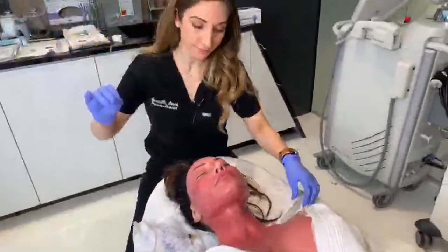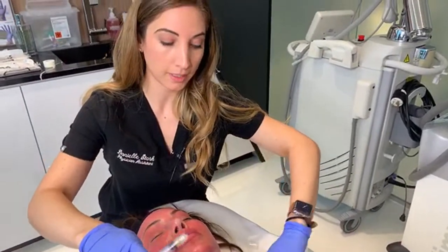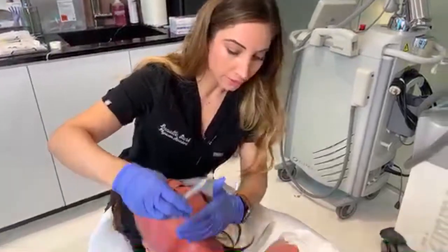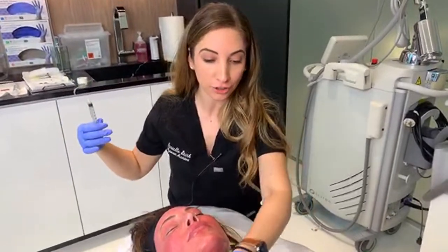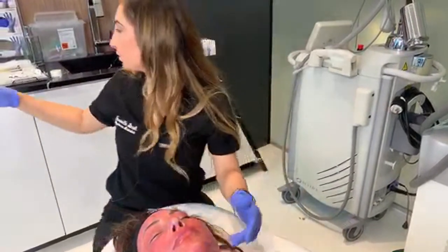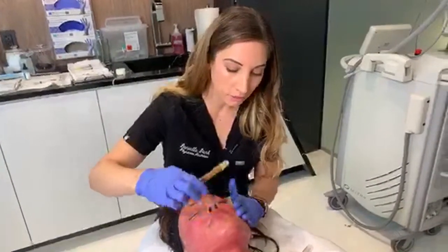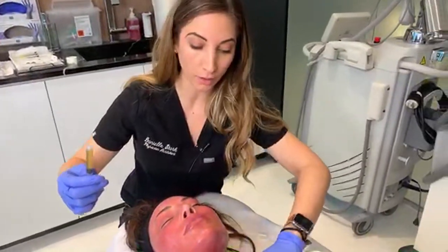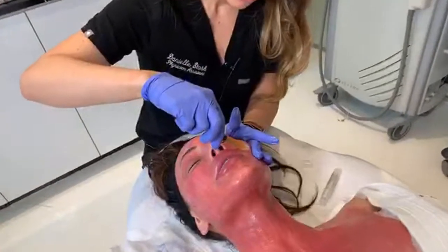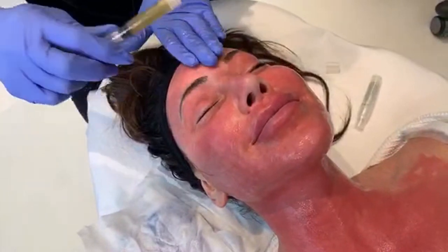So for those just tuning in, can you just explain what the erbium laser does? Yeah, so erbium laser uses laser energy that targets the resurfacing. So it's a non-ablative laser unless you choose the ablative. So it's a fractional, and what that means is that it's only targeting a fraction of the skin at a time. So you can make your treatment more aggressive or less aggressive depending on what your downtime is like and what your skin needs are. And you're looking at getting some light resurfacing or moderate or even more aggressive resurfacing depending on how we adjust it. My eyes are nice and hot right now. Your eyes are getting more swollen by the minute. They sure are. So I'm just applying a little bit more PRP.